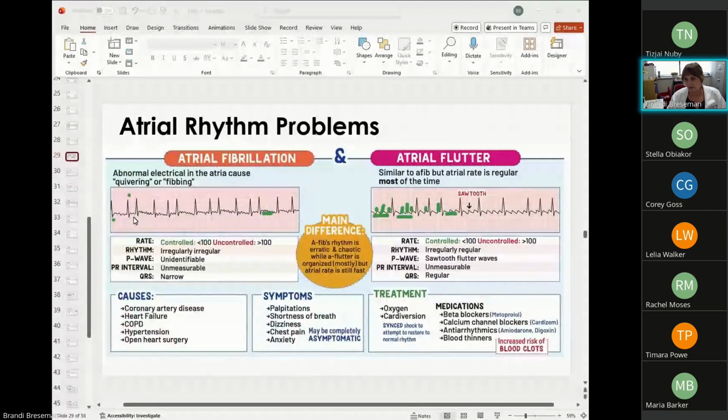Or they're going to decompensate and die. And then we are going to be shocking them anyways. But that is synchronized cardioversion. If my patient's awake and talking to me, I am going to be doing synchronized cardioversion.